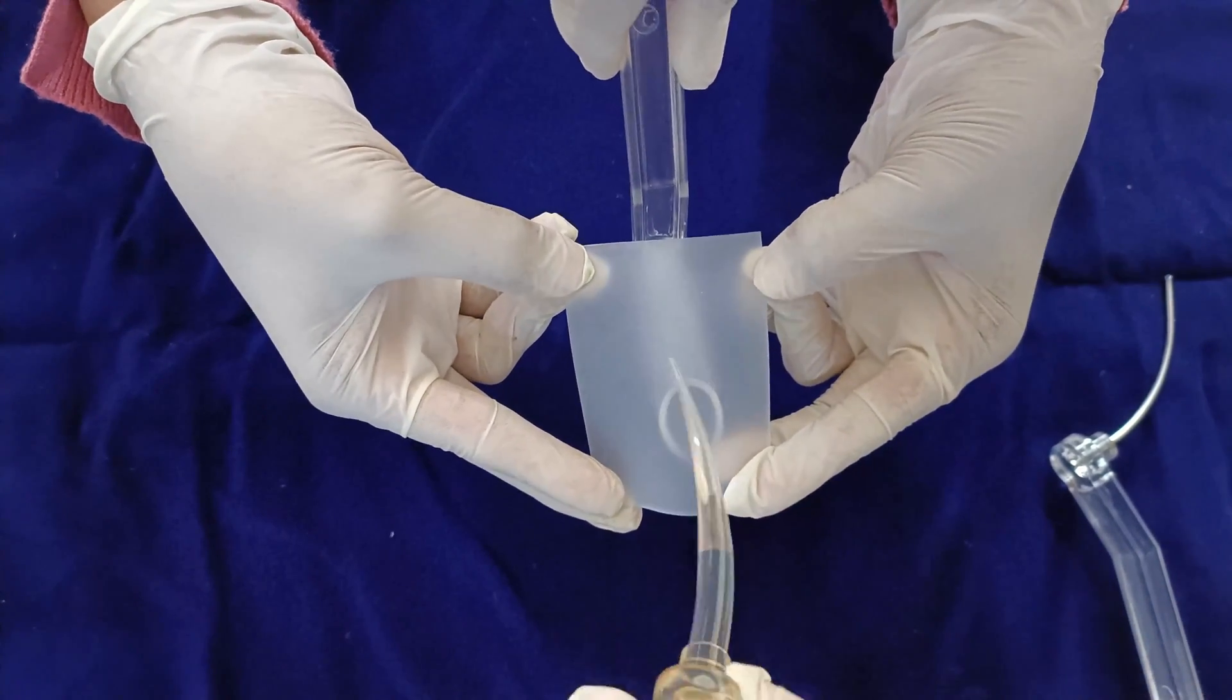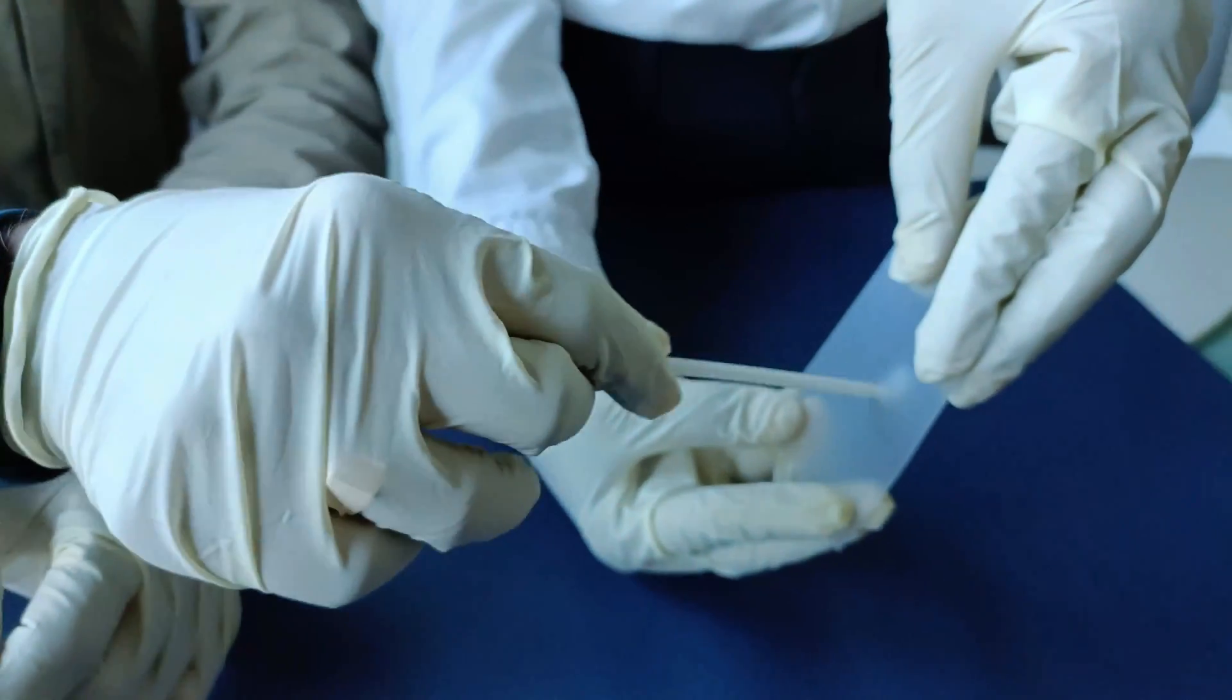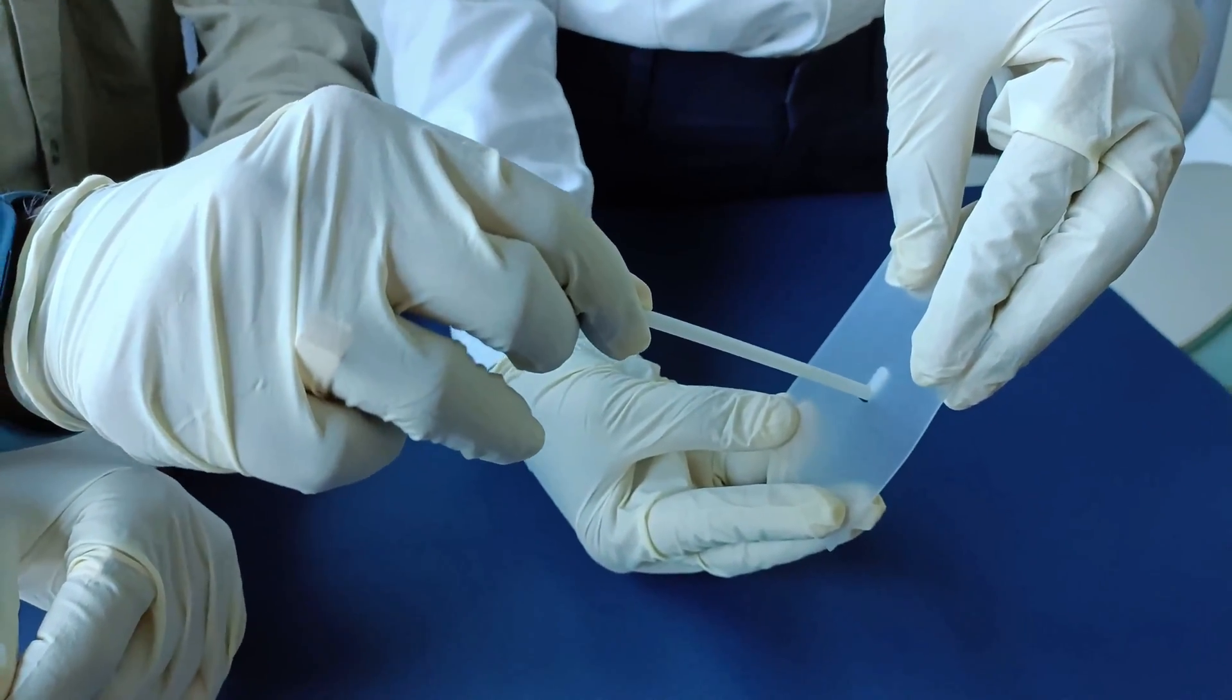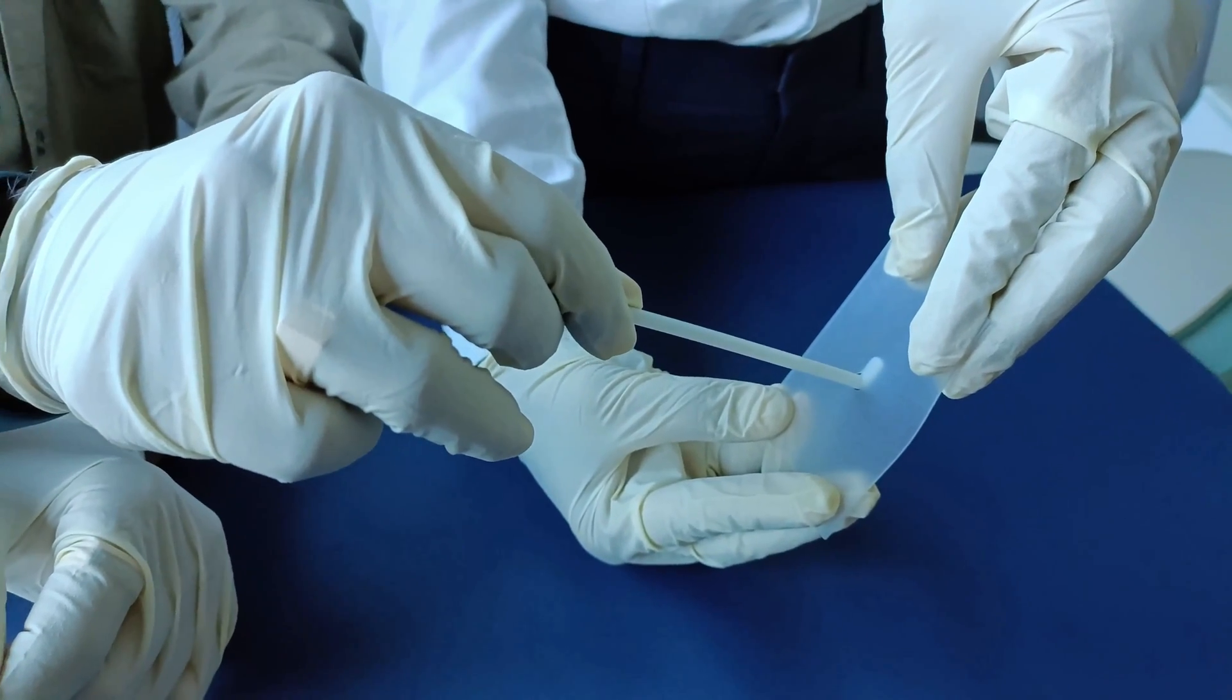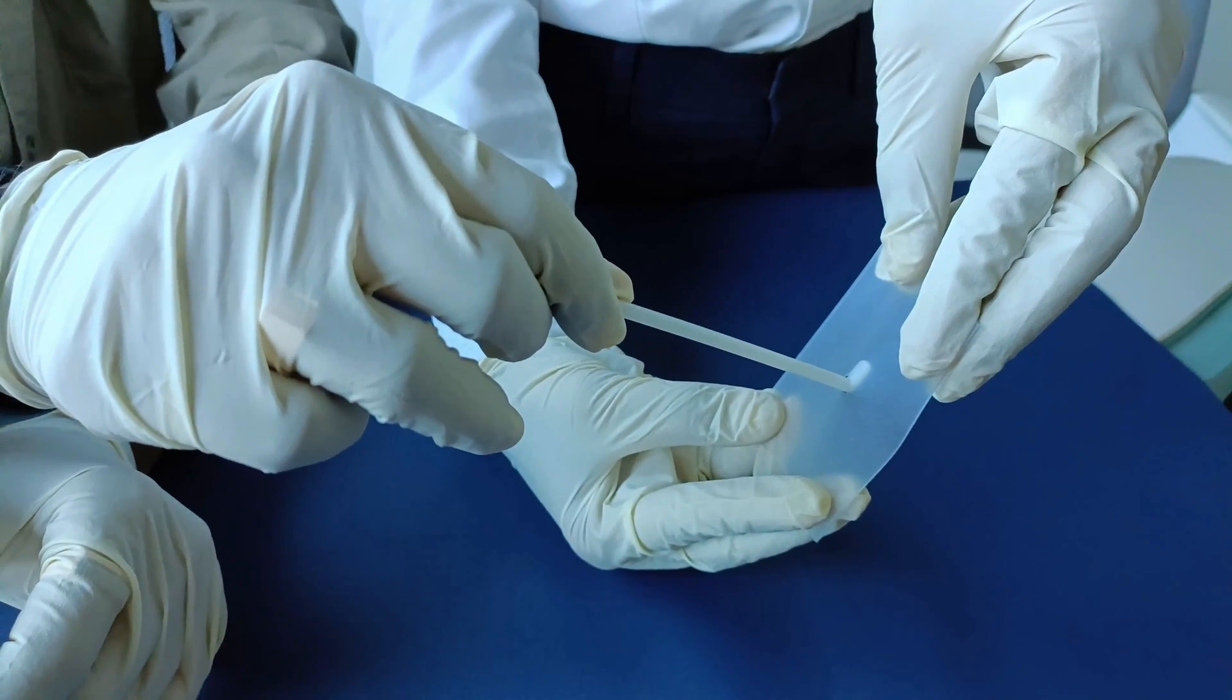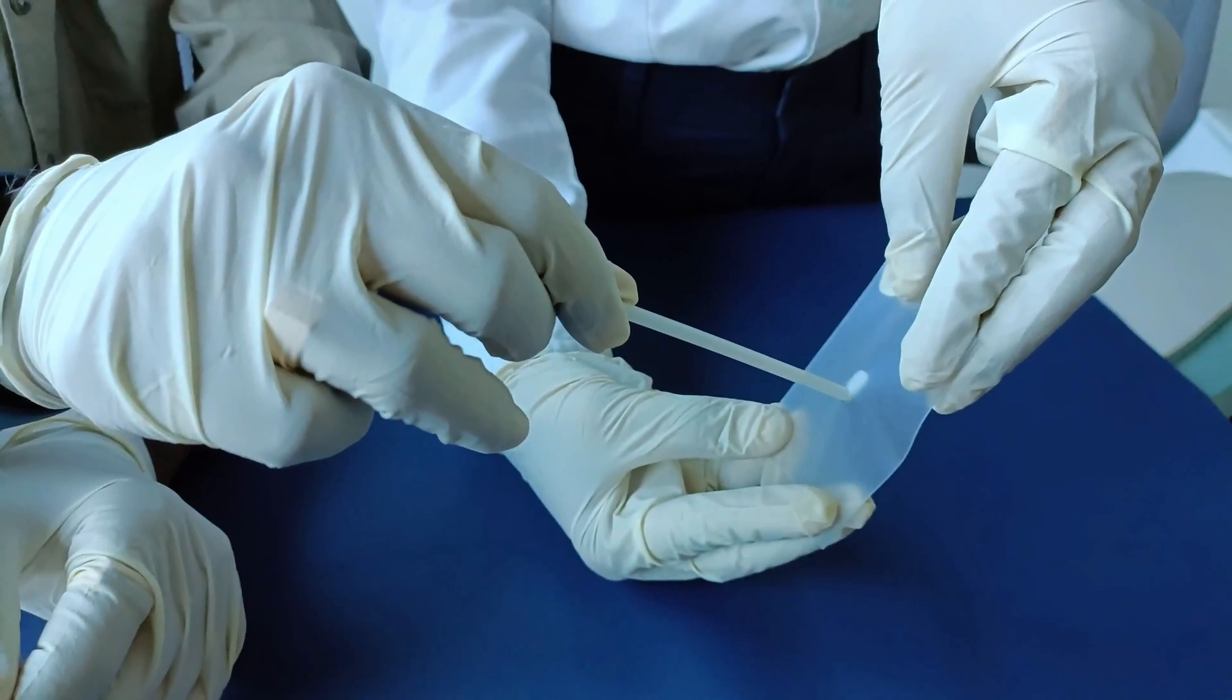For identifying the perfect size of voice prosthesis amongst the available length options of 4mm, 6mm, 8mm, 10mm, insert the sizer in the puncture area up to the esophagus wall and mark the distance with the help of blue, green, yellow and red colored bands for measuring the distance between trachea and esophagus. This will help you to identify the right size of the voice prosthesis that needs to be implanted.